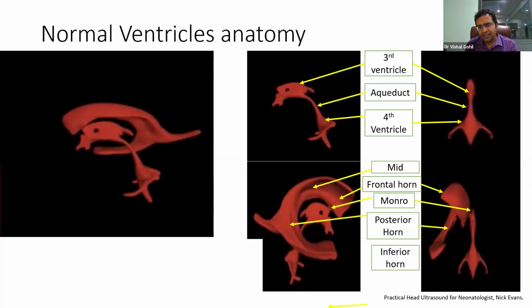So when you do the sagittal lateral view, you are putting your probe over here. Am I right? And swipe to either the right or left side. So when you swipe, like suppose on the right side, you are cutting the lateral ventricle like this. That's why you can see the crescent shape on your echo machine. When you do the coronal view, you put the probe with the marker on the right side, and you are cutting the frontal horn over here. You can see the lateral ventricle, and you can see the third ventricle, which is connected by the foramen of Monro.